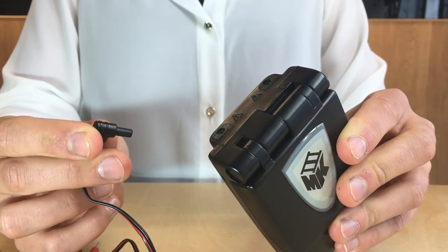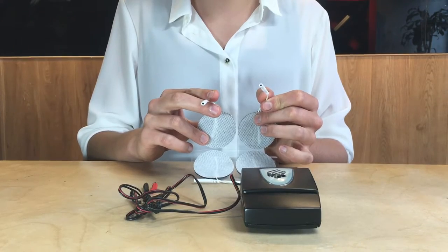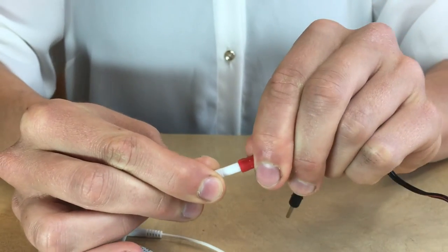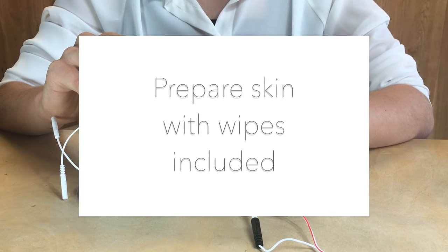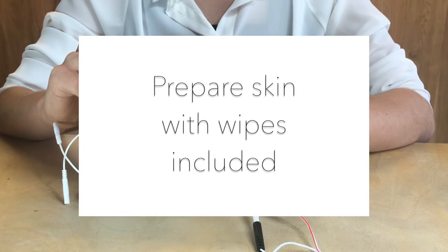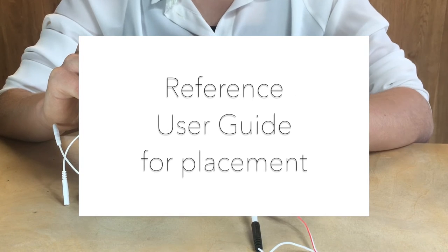Connect either lead wire to the socket found at the top of the device. The pinheads of the lead wires can then be inserted into the electrodes. This process can also be done if you are using the second channel of the device. Before electrode placement, skin can be prepared by using the wipes included.